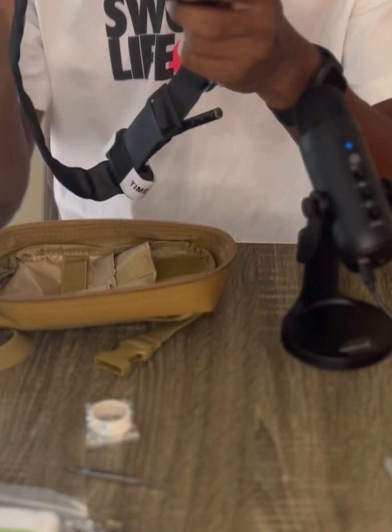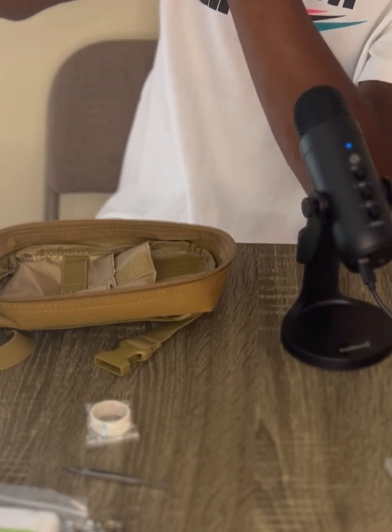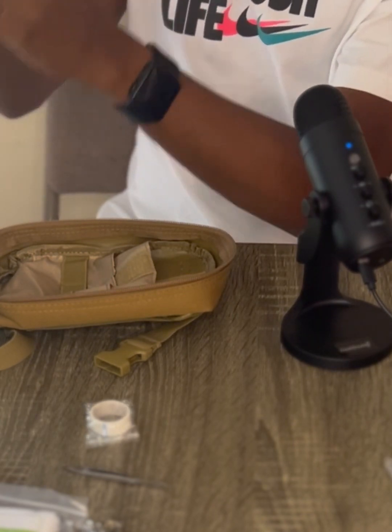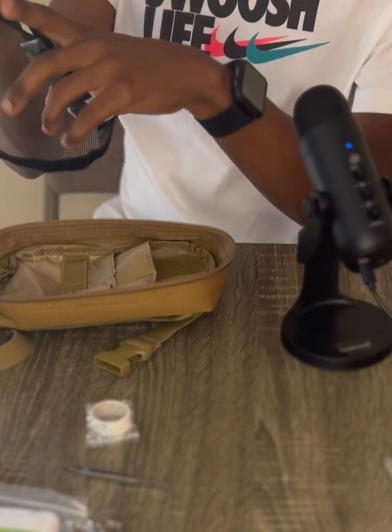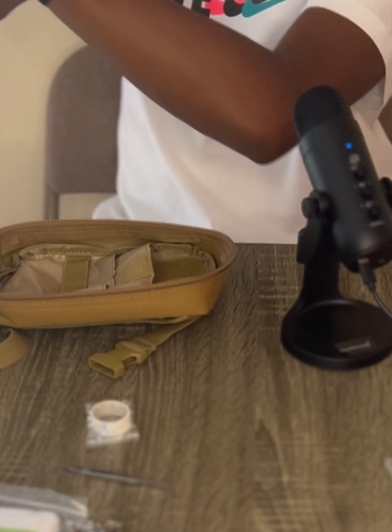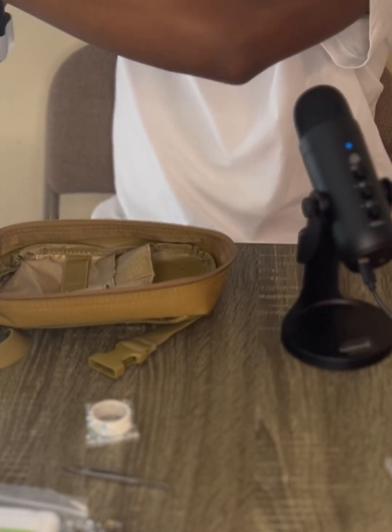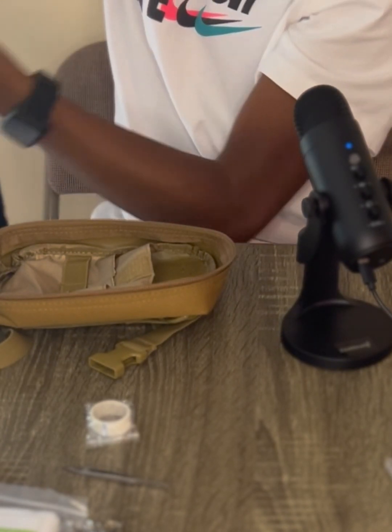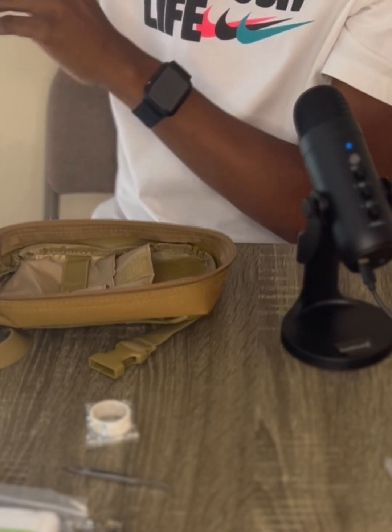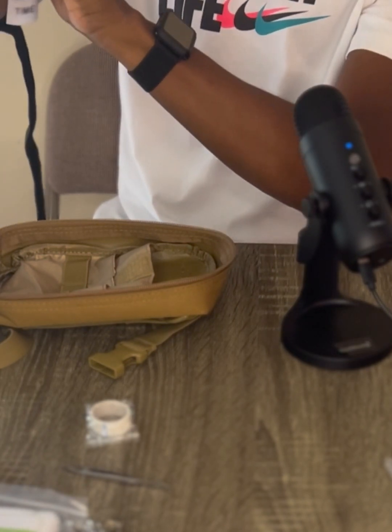Best way to show you how to use this: let's say I got a cut here close to my wrist. If I was bleeding profusely, first thing I would do is grab my tourniquet, bring it over — if the wound is here, I put it two to three inches above the wound. Then I tighten it down as much as possible with the velcro strap. Two to three inches above the wound — and then I'm gonna take the windlass and twist it.